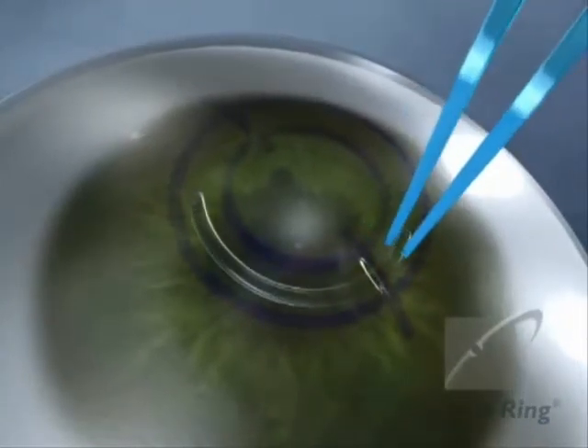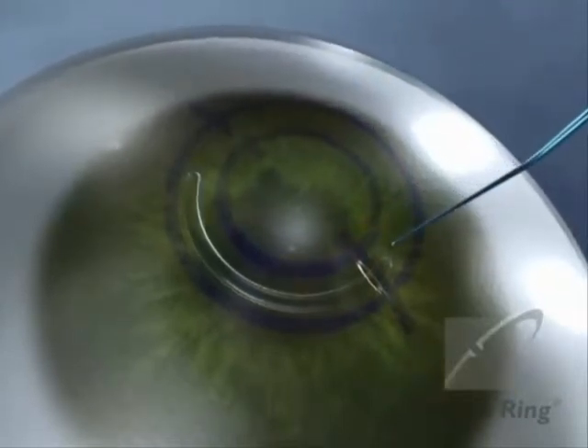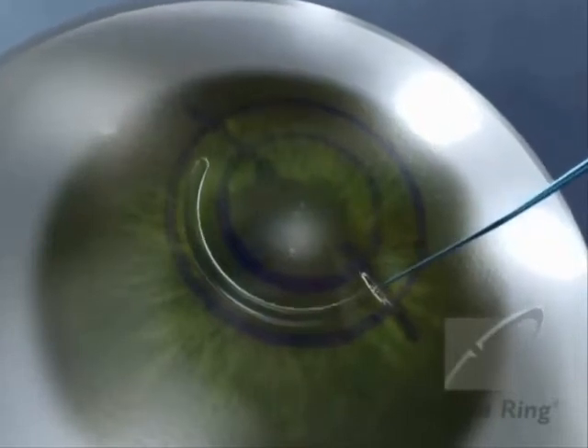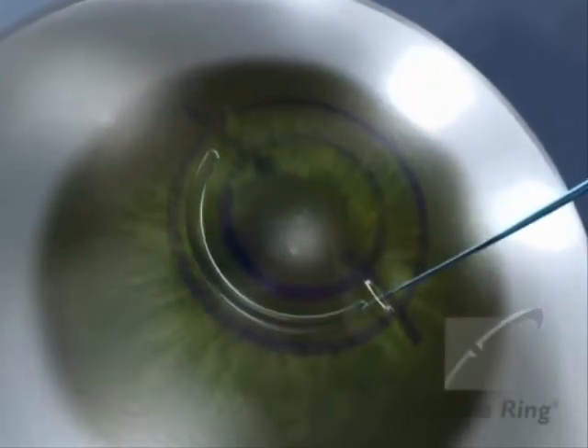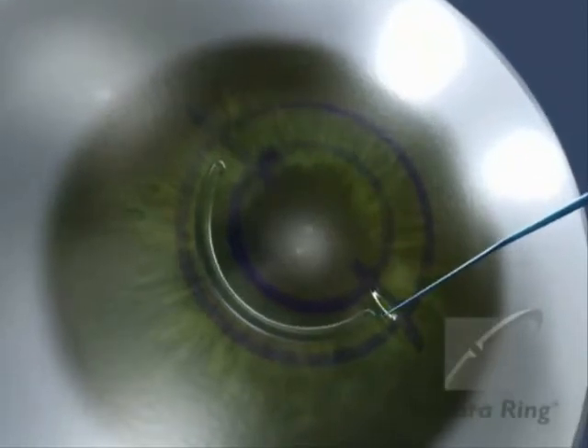Use the Sinsuke hook in the orifice of the ring to push the ring into the tunnel. The ring should finally rest at least one millimeter of distance from the incision. Repeat this procedure for the implantation of both segments.